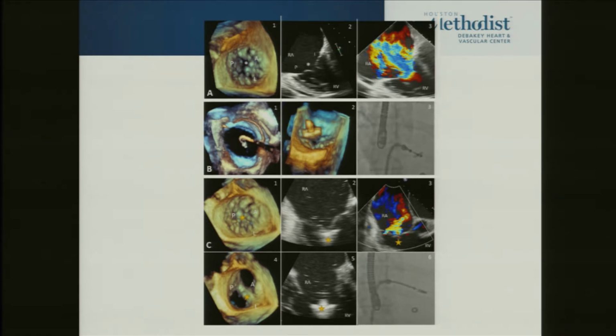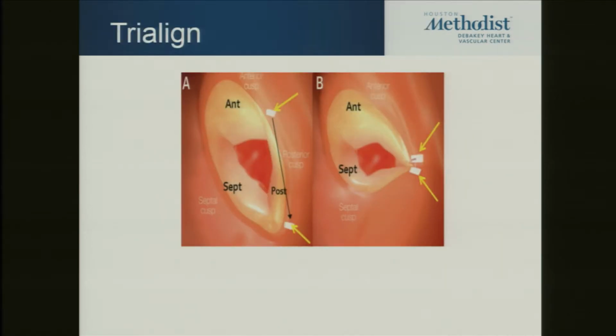So probably about a 50 to 60% reduction with the mitral clip in the tricuspid position. But this guy was cirrhotic, had ascites, and was getting paracentesis every week. His legs were tree trunks. In the first week after we did this procedure, he diuresed almost 22 liters without us having to do anything. He just suddenly had real forward flow going. That was about a year and a half ago, and he continues to do well.